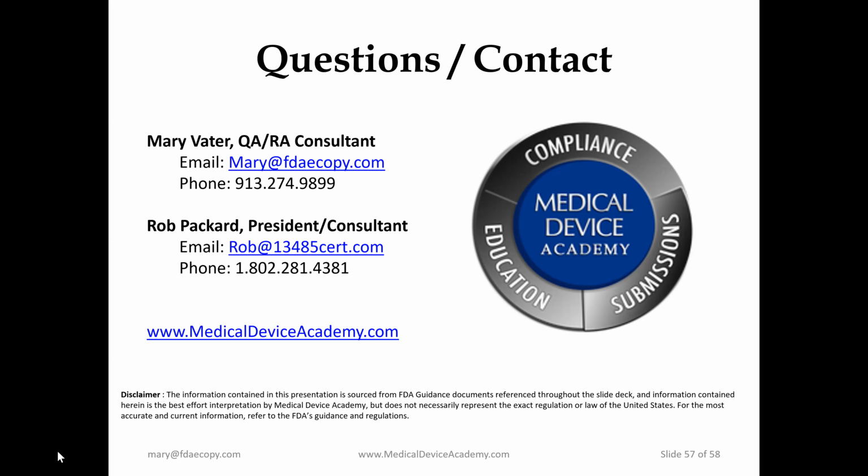But when you are talking about a minor modification, it could affect the usability of the device, and human factors testing might be something the FDA wants to see. Or it might be something that has no impact on human factors and usability, and therefore the FDA wouldn't need to see that. So it depends on the specific change you're making.